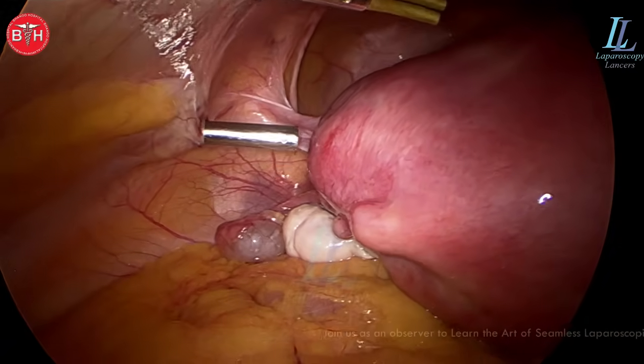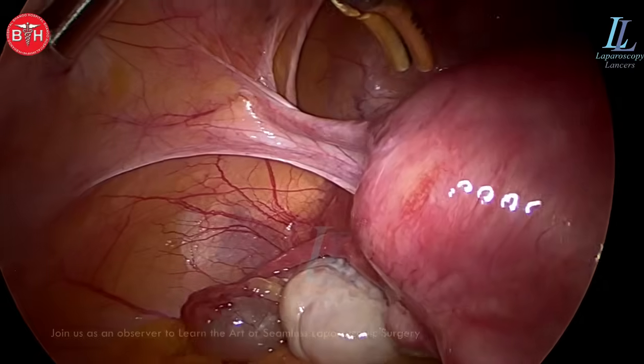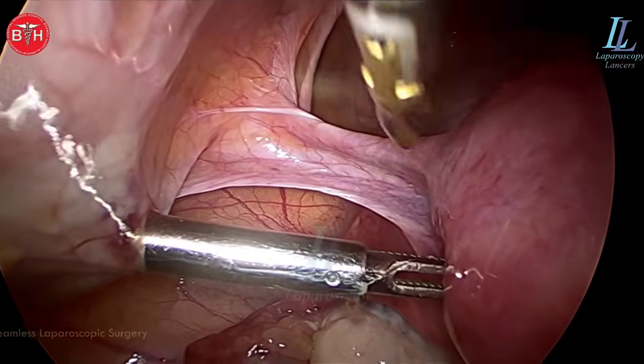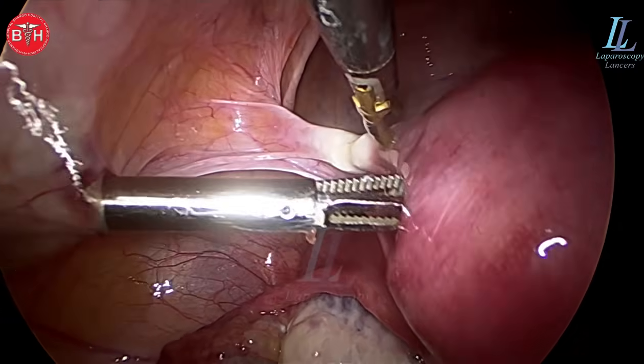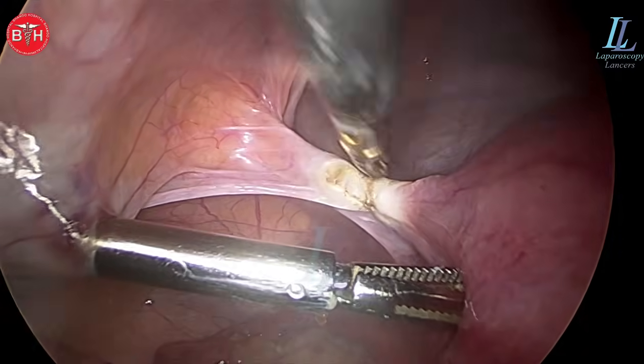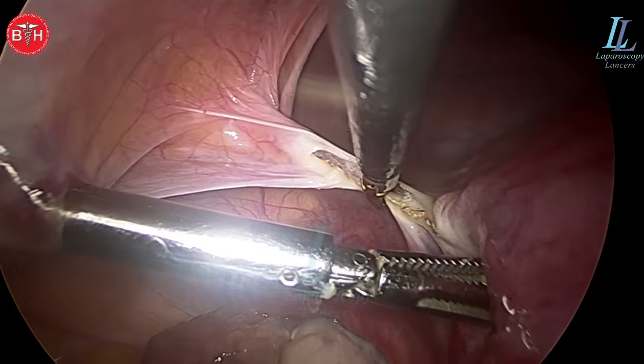That's the case under spinal anesthesia, 14 to 16 week uterus — a large uterus of course — and only ipsilateral ports will be used, which is my favorite. You must all know the importance of using ipsilateral ports: the surgery is fast, no shoulder fatigue, and you are not coming in the way of your camera assistant or camera surgeon.